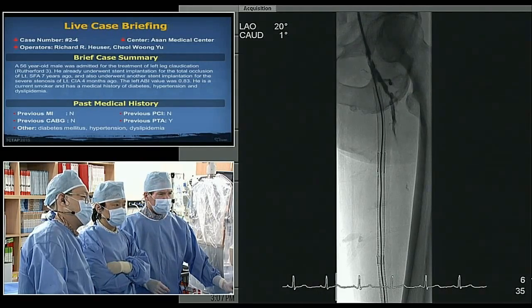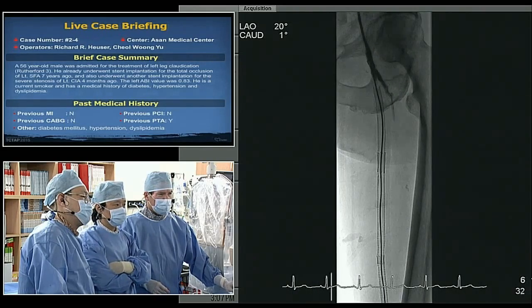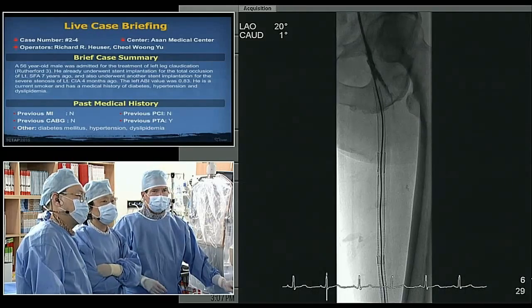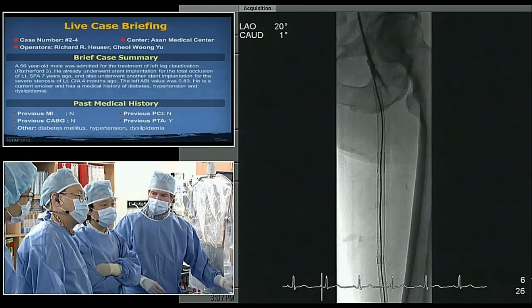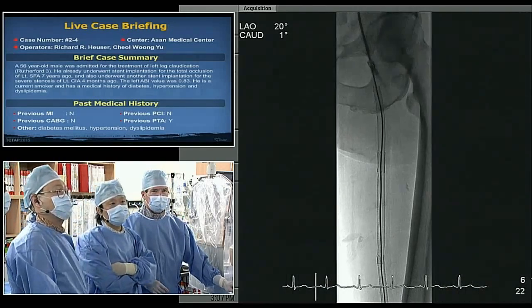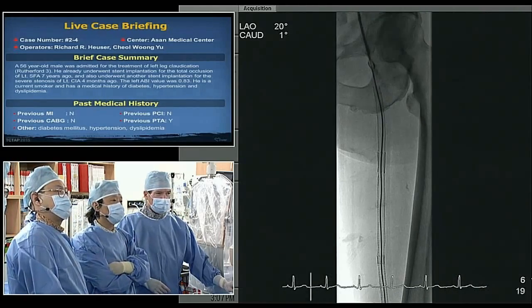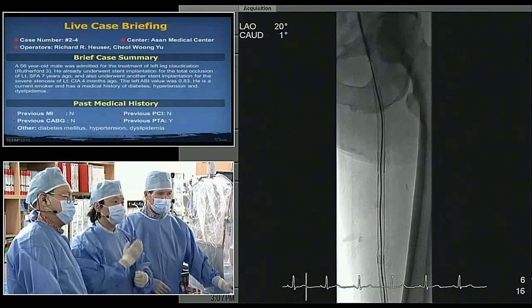Rich, this is Lawrence Garcia. Did his symptoms change acutely, or did they progress slowly? Is there anything that would suggest this was thrombotic? We don't know. I have no information about the patient's symptoms. Only that the patient complained recently of claudication in a crescendo pattern.